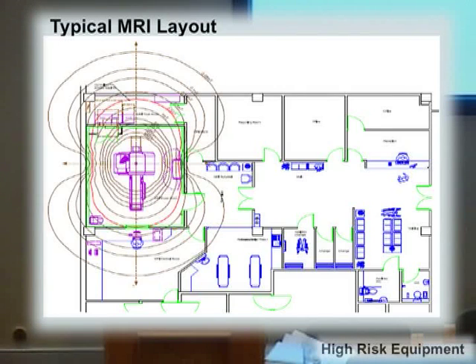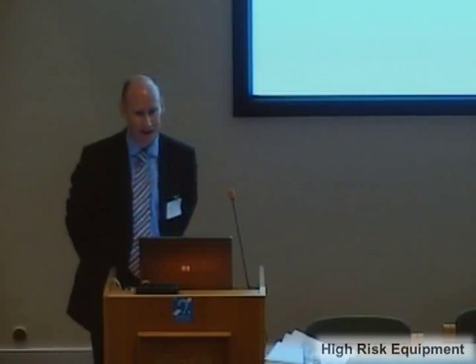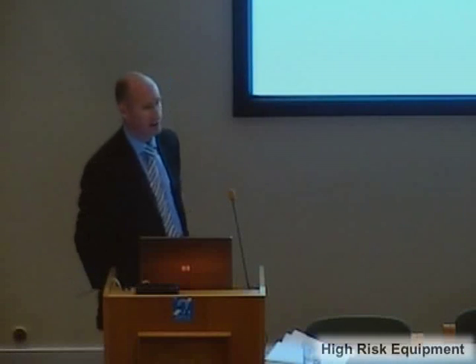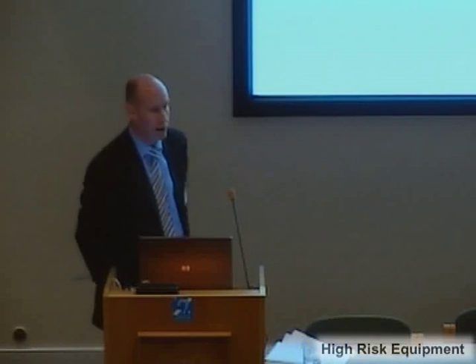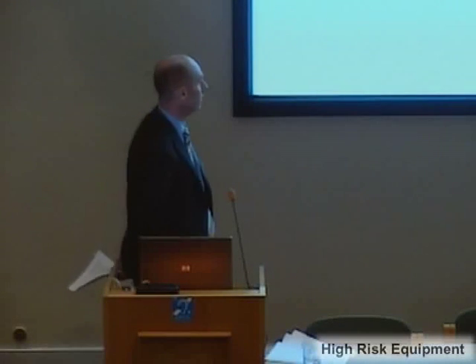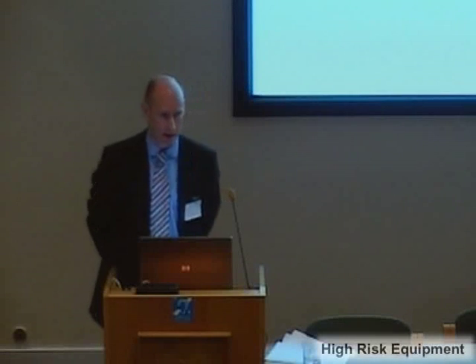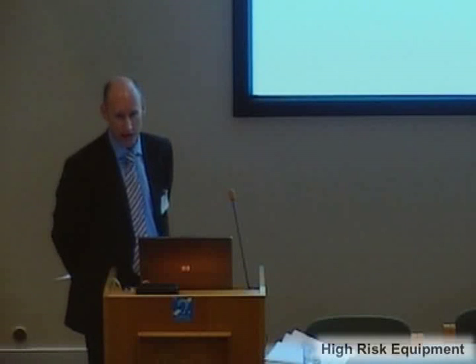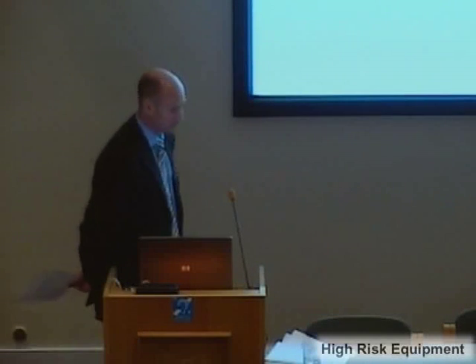You'll notice that I've tried to position this on an outside wall, mainly for delivery. We've touched on it very briefly in a few other presentations, but an MRI can weigh anything up to 13 to 15 tonnes, and normally speaking, these MRIs are craned in and then pushed through a hole in the wall. If you've got to push a 13 to 15 ton magnet through a whole hospital department, it's going to be a problem. So I would always recommend we get this MRI suite on the outside of the building.